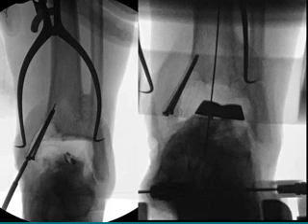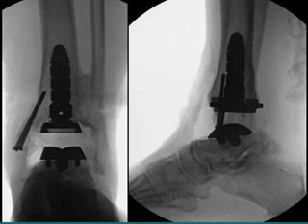Well, he didn't want to get a fusion, and so we wanted to oblige him. The first thing I do when I'm revising the Agility ankle is to put prophylactic screws in, particularly along the medial malleolus here, because you know this is just ready to break. On the lateral side, I won't hesitate to put screws in there, but it looked like the fibula was reasonably intact. Now, the nice thing about using the INBONE for these patients is that we have a nice flat cut on the top of the talus. So as long as we have a rim of talus left, we can mount that flat prosthesis onto that area and get a pretty good stable construct.